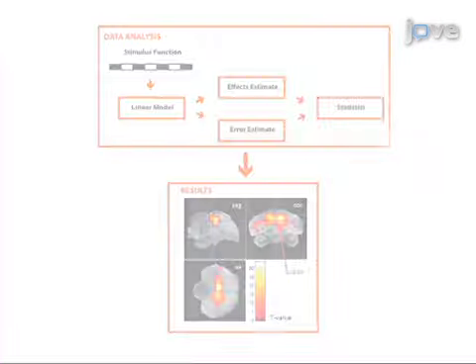the auditory stimuli. The main advantage of this technique over other more commonly used methods in songbird research, like electrophysiology, histology, and molecular mapping techniques, is that fMRI is a non-invasive in vivo method which allows one to study the same subject over time and to address the whole brain at once without prior hypothesis on the localization of the neural substrates involved in the investigated process.